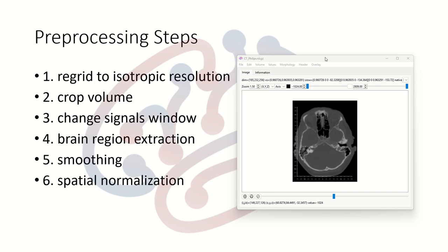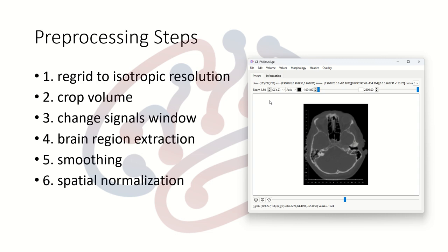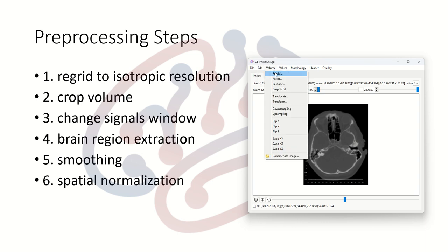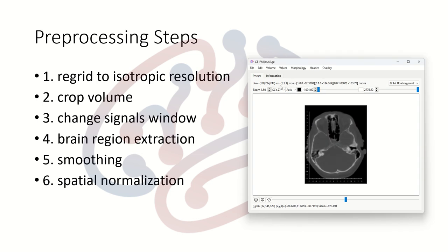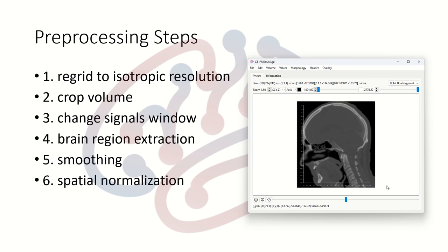The first pre-processing step is to regrid the image to isotropic resolution. For most acquisitions the voxel size XYZ resolution may not be the same, so it is better to regrid to isotropic so that spatial normalization is easier. Go to the Volume menu, click on Regrid, choose a resolution close to the original — here I choose one millimeter. You only need to put in one value and DSS Studio will regrid to that resolution.